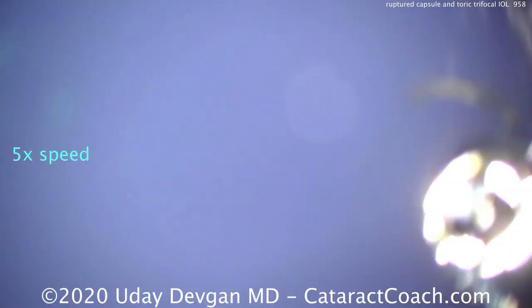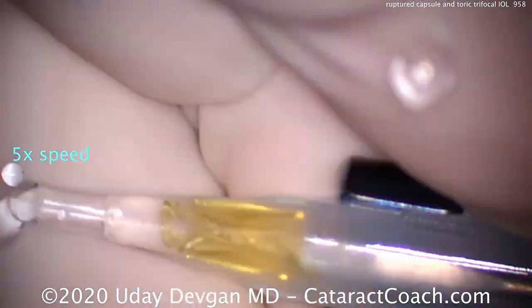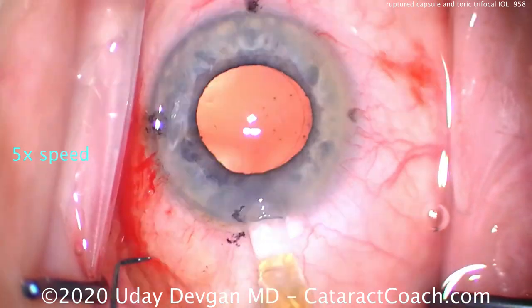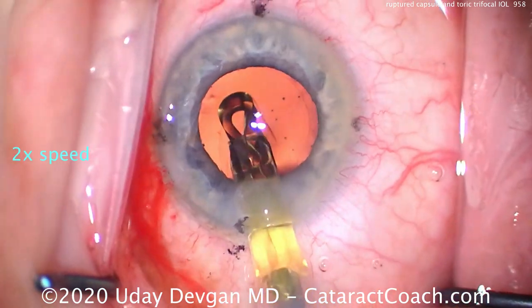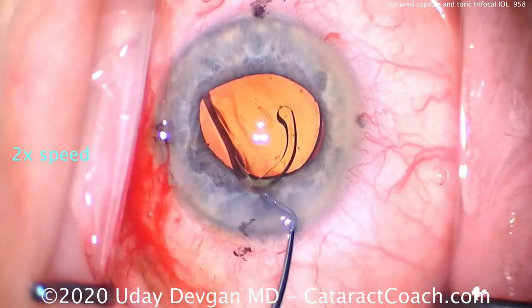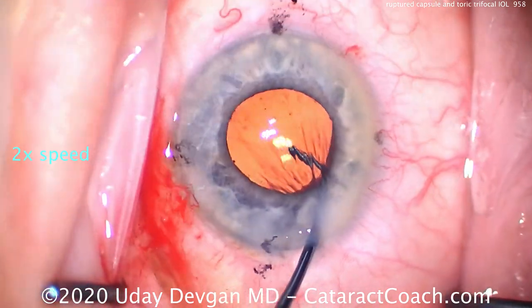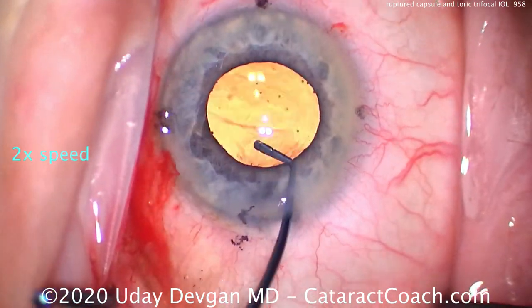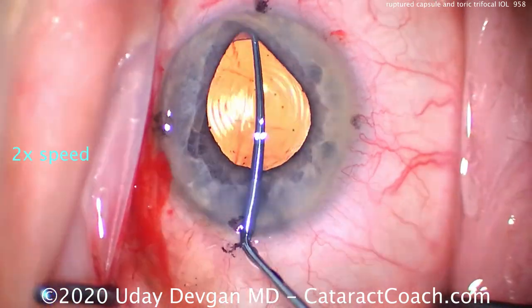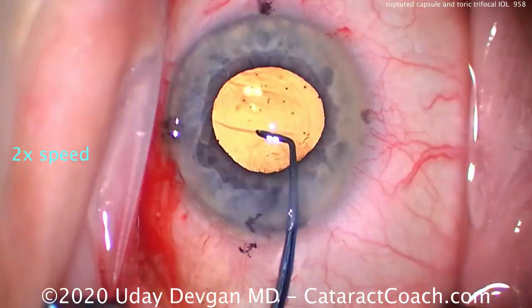Now we'll load up the lens — a trifocal toric single-piece acrylic lens. We'll put it in the capsule bag and slow things down to get it into the exact position we want. We're going to rotate it here to get it into the appropriate position. And look what happened — the posterior capsule opening ended up becoming larger.